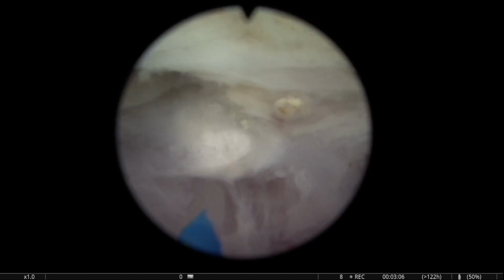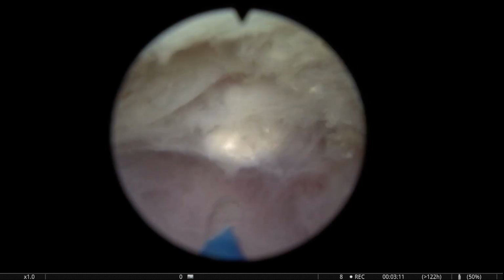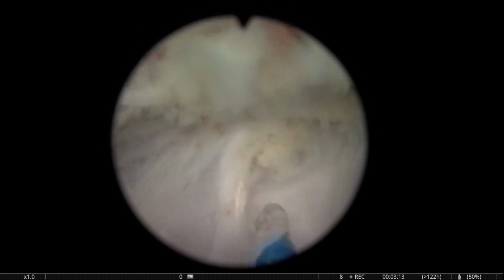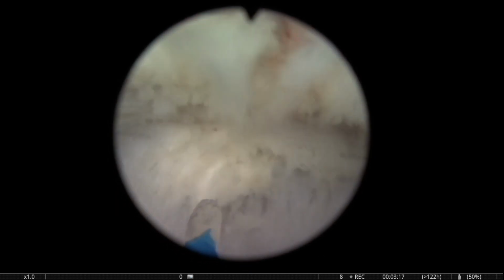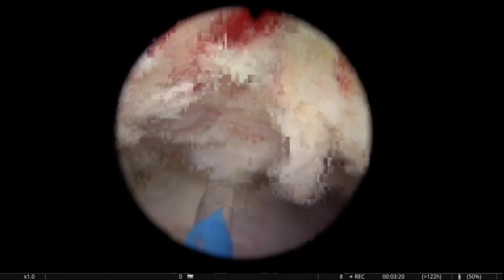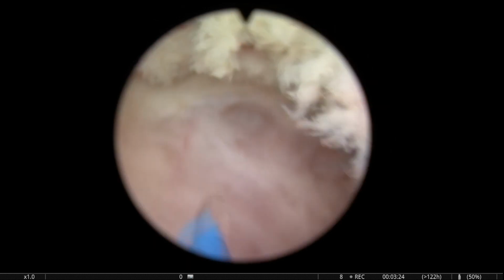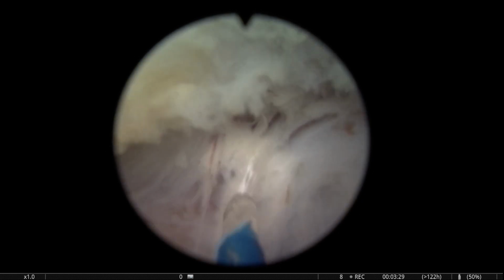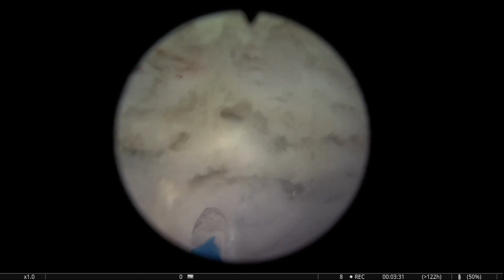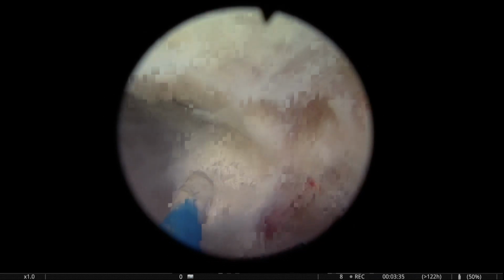Here you can see how I entered, the classic way, the normal way. Entered one side of the veru, firing a little bit against the floor of the veru, and then connect in the midline. You see, there is not much tissue there, but there is tissue. Okay, so if you think that this patient is going to have his second operation, maybe it's nice to try to make it the last. So that's then the development of the posterior line.